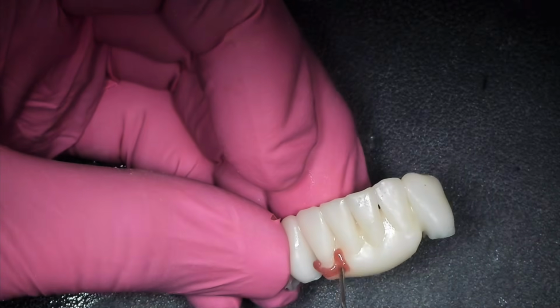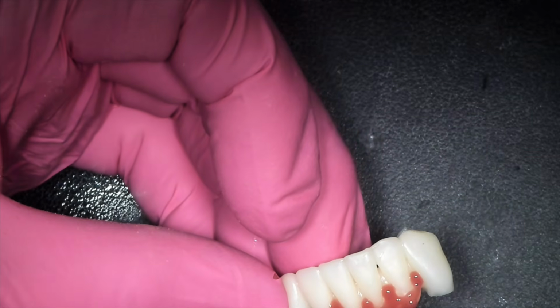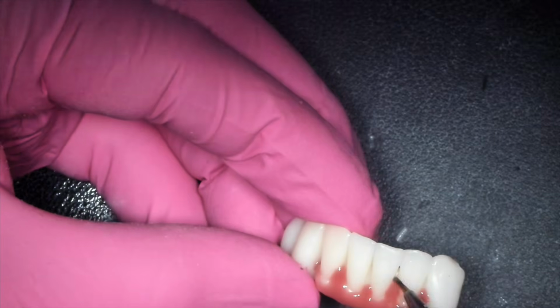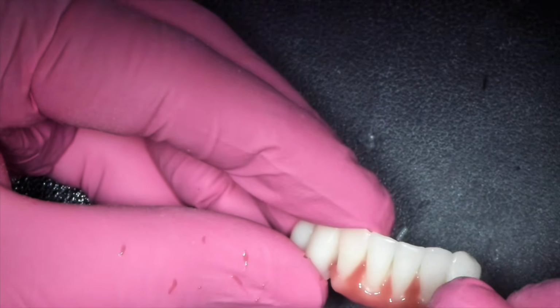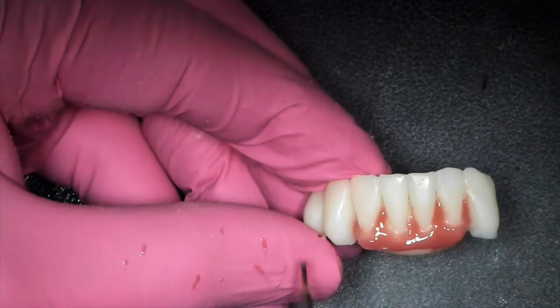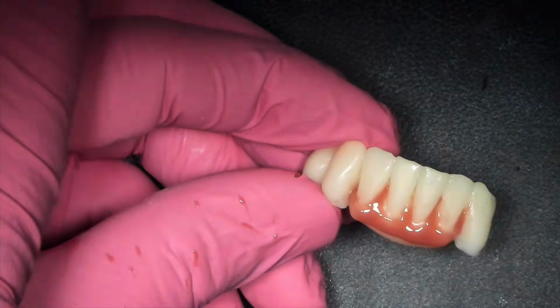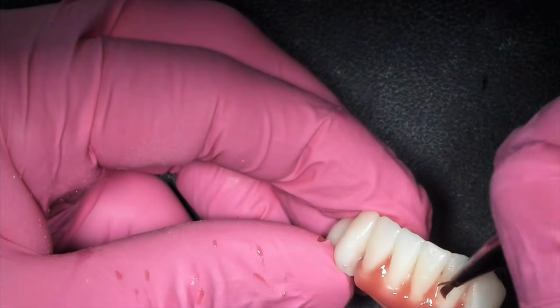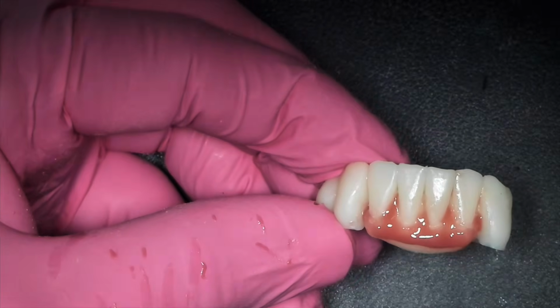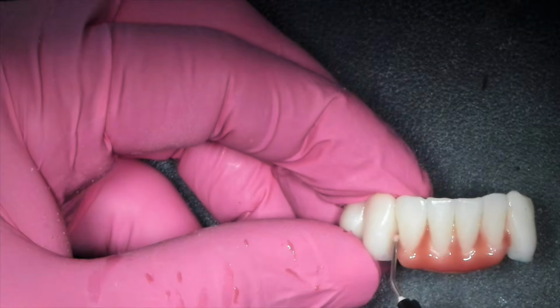And now I'm going to go ahead and paint the gingiva. I'm trying out a new system here, which is just 2 colors. There's this dark pink base color that you put on, and then you put a gingival margin color on top of that. So it's just 2 steps, and it's flowable and easy to use. After you do that base color, you cure it, and then you work in some margin color. It's similar to Annex Dent, but I think maybe just a little bit easier to use. Hopefully less expensive when it comes out.